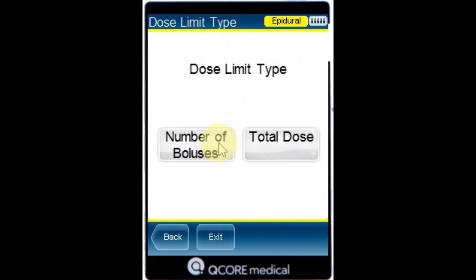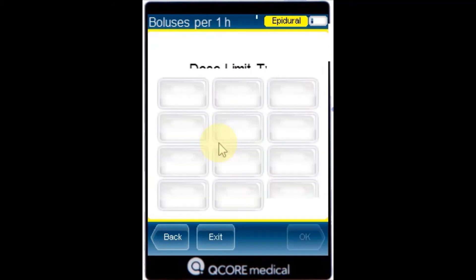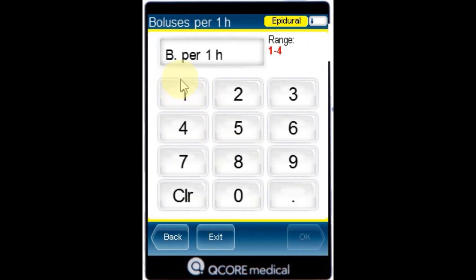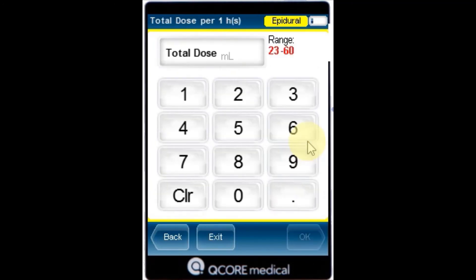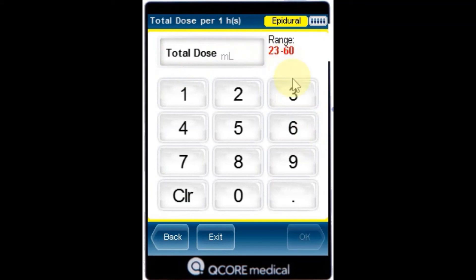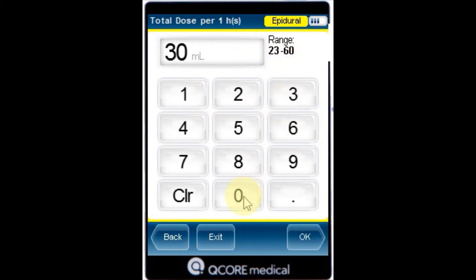Number of Boluses limits the maximum number of boluses. Total Dose defines the maximum amount of medication that may be delivered within a one or four hour period. After the Dose Limit Type is selected, using the keypad, enter the number of boluses or maximum dose and press OK.